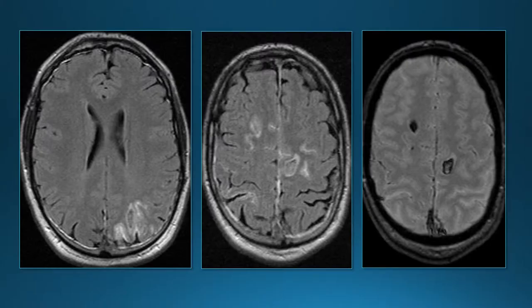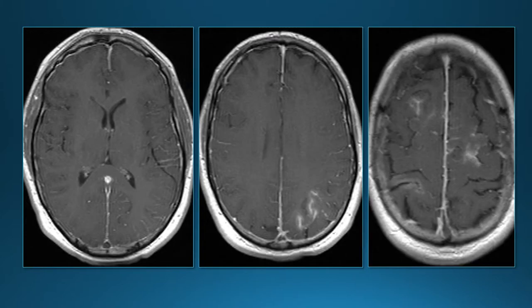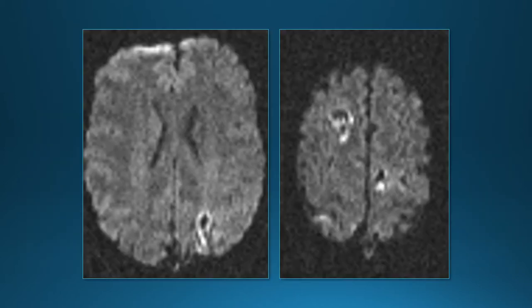On MRI FLAIR images, there is high signal along gyri and into some sulci, with areas of hemorrhage on gradient echo images. Post-contrast T1 shows some linear areas of enhancement, some along the pial surface of the brain. Looking carefully, we can see a filling defect in the sagittal sinus. Diffusion-weighted images in this case show not much restricted diffusion — just small areas associated with hemorrhage.